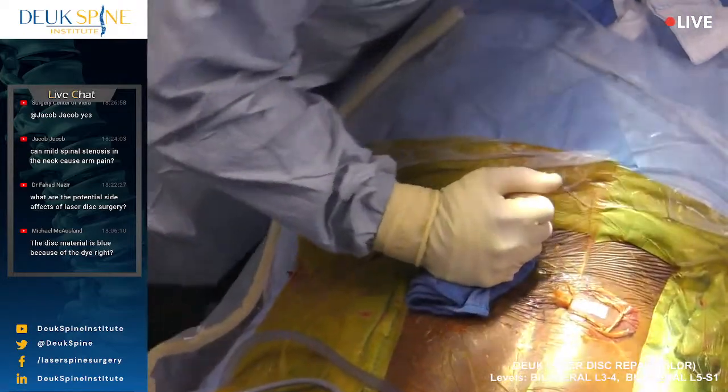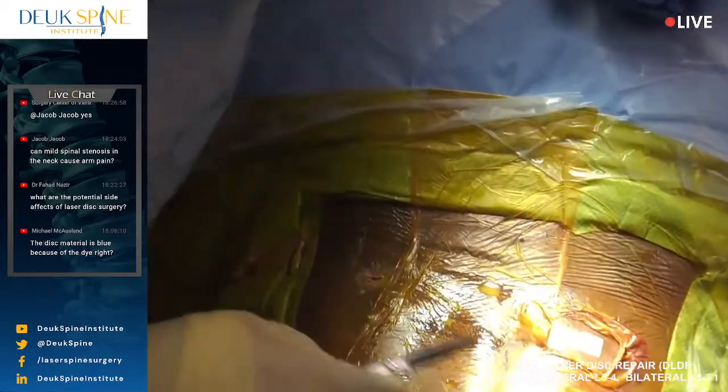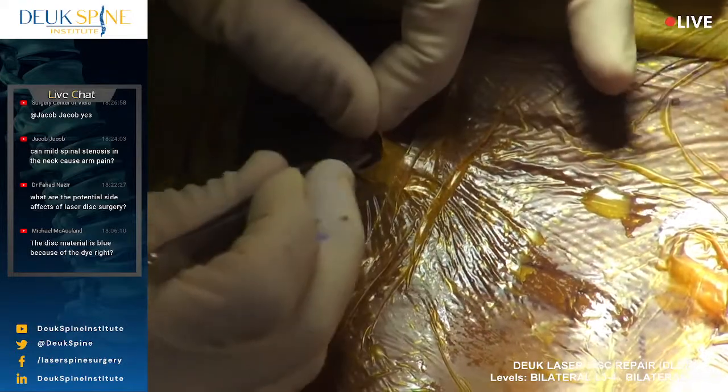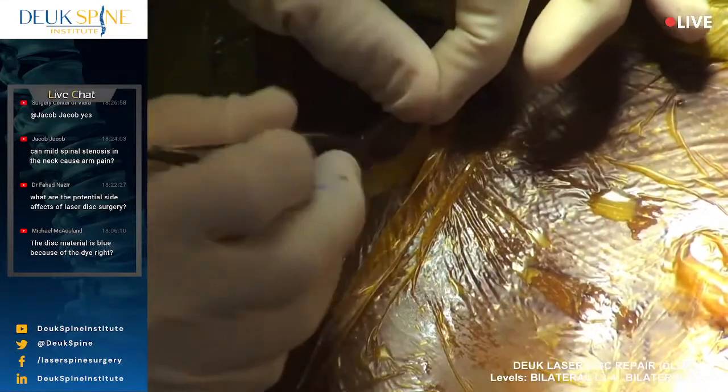I have a ray tech off. Our last surgery for the day will be a 2-level lumbar, L4-5, L5-S1. Yes, L4-5, L5-S1. He's got a big herniation. Any questions? Type them up and I'll answer them for you.